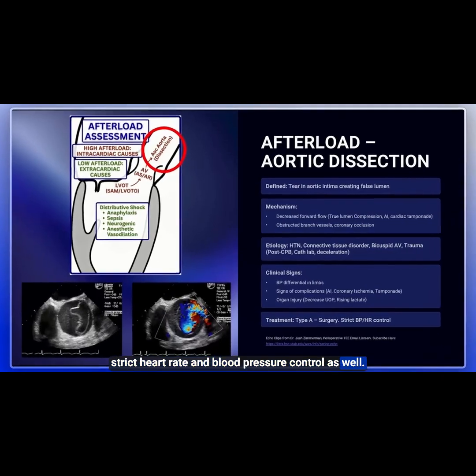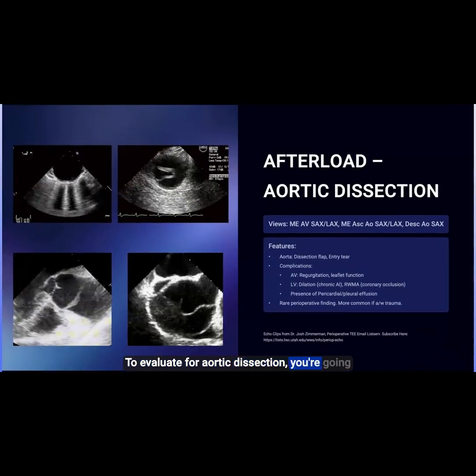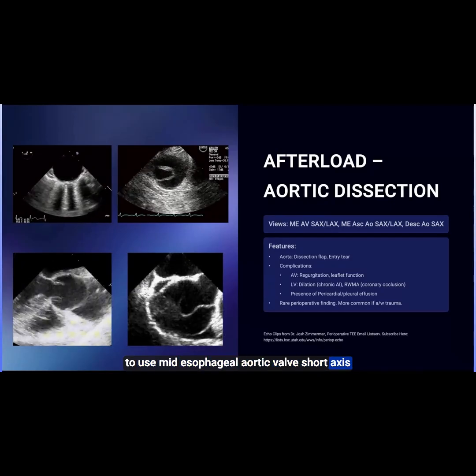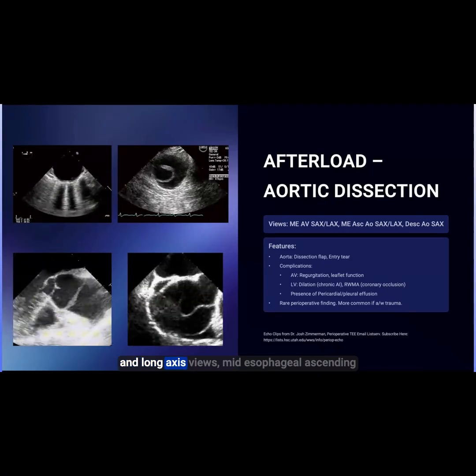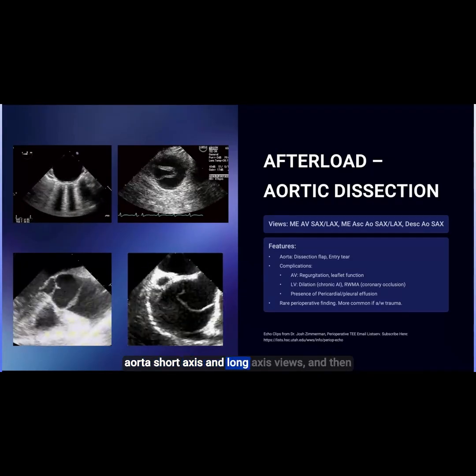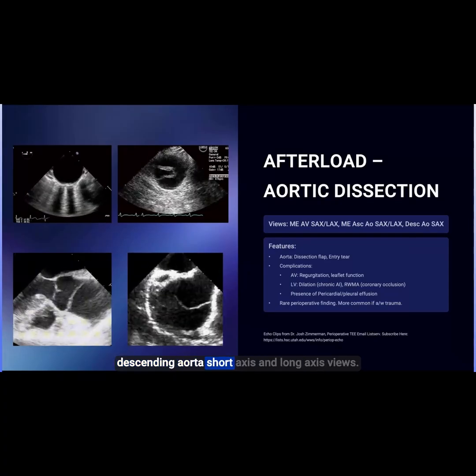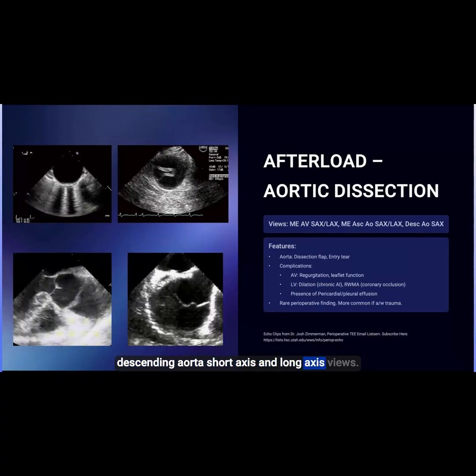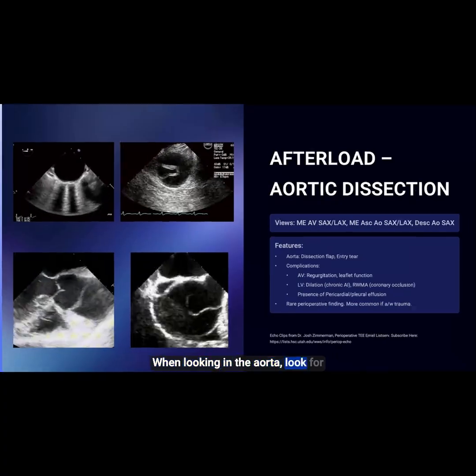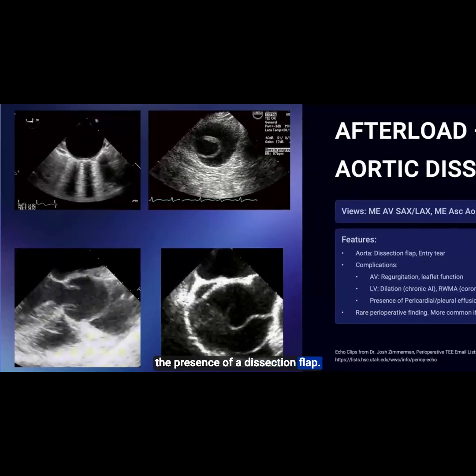To evaluate for aortic dissection on echocardiography, use the mid-esophageal aortic valve short axis and long axis views, mid-esophageal ascending aorta short axis and long axis views, and then descending aorta short axis and long axis views. When looking in the aorta, look for the presence of a dissection flap.